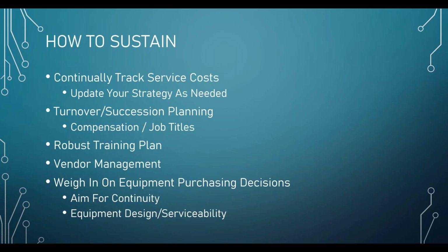And then when it comes to imaging equipment, it's also no secret that a lot of them are very guarded with what they'll let us have access to, right? When you take the big 3, there's one that's pretty forthcoming. In fact, you can go on the website and download whatever you need: service manuals, installation manuals. They'll sell you parts. You can call their parts guys for an MRI and just say, hey, I need the cradle latch for this system, and they will give you the part number. And sometimes they'll even send you diagrams for it.